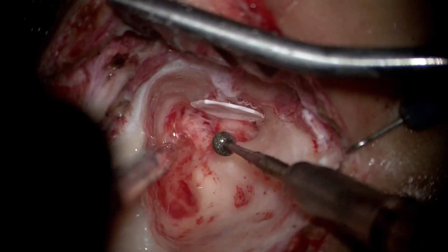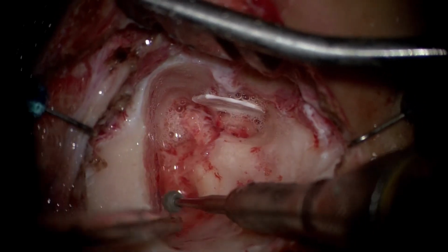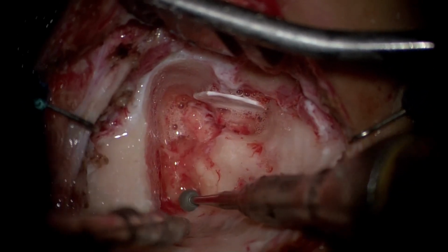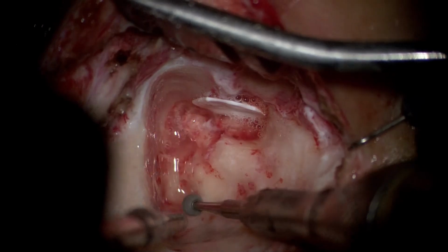This is the video of a canal wall down mastoidectomy for an attic cholesteatoma. However, in this particular instance, we will focus mostly on the soft tissue dissection work in the mesotympanum and the epitympanum as compared to just the drilling.